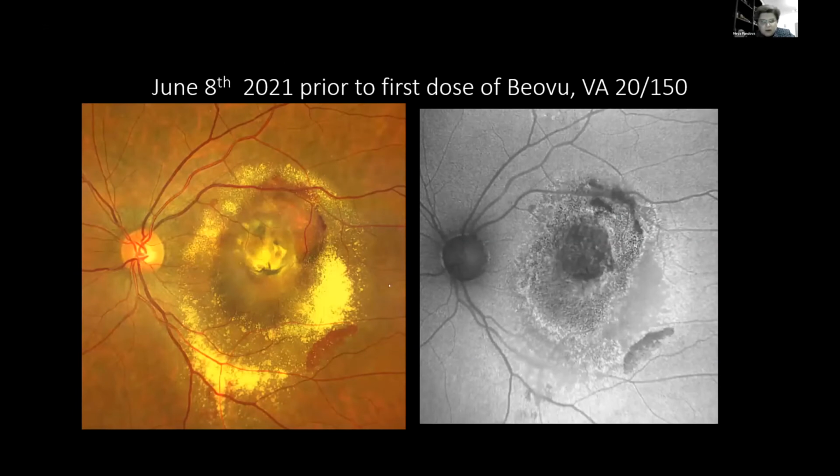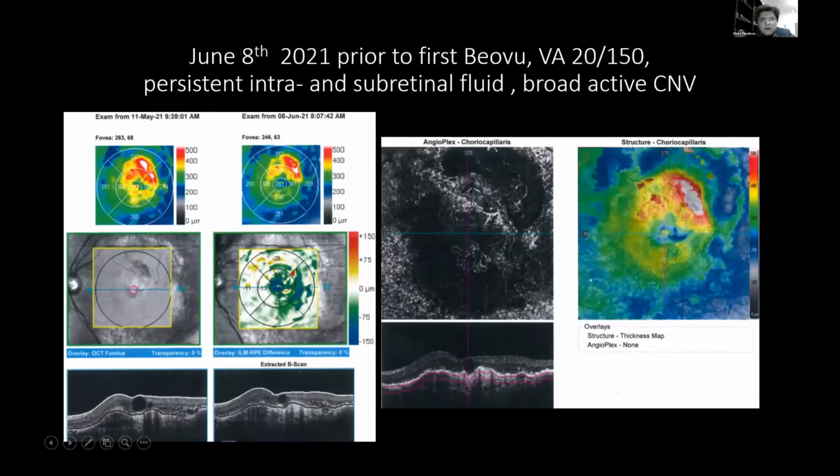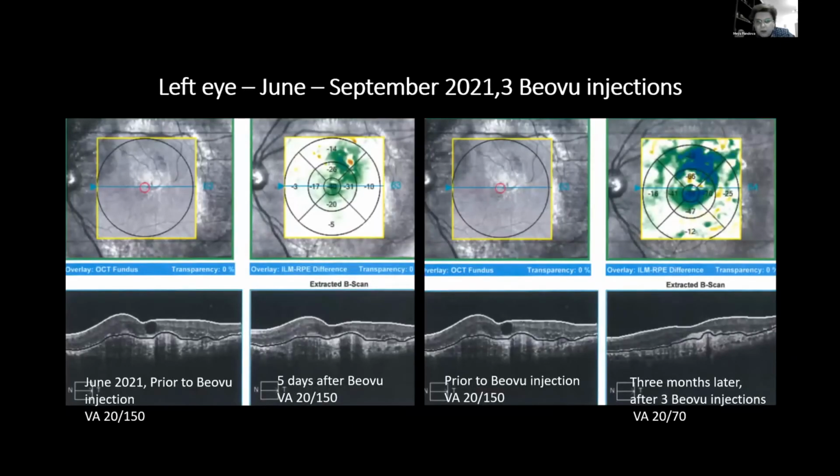You can see the hemorrhages and the diffuse granulated appearance on the autofluorescence with a fairly large atrophic area right in the macula that was associated with an active neovascular membrane well visualized in this custom slab. Despite the Eylea treatment, you see he's still having intraretinal cystic changes, quite a highly active membrane. So that is what happened after the 5 months.